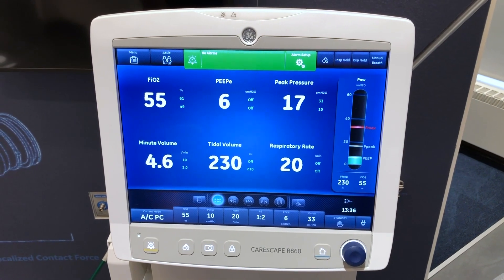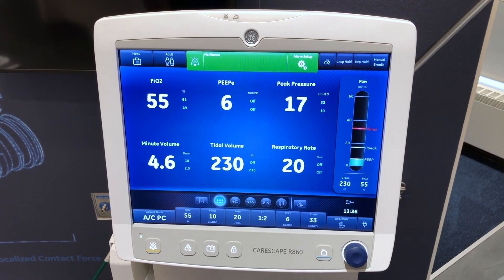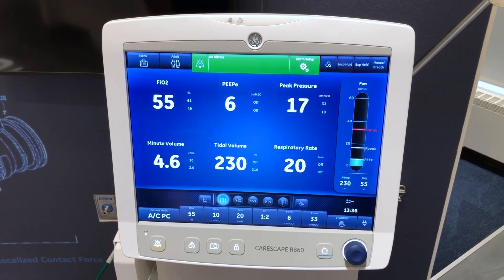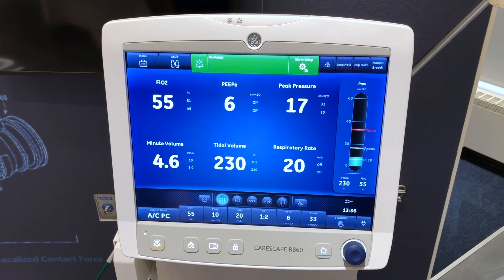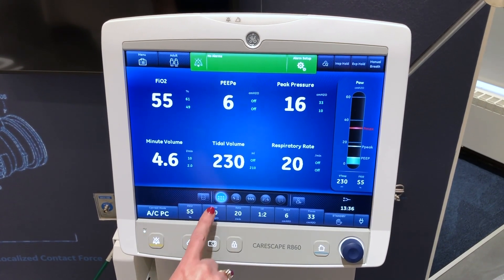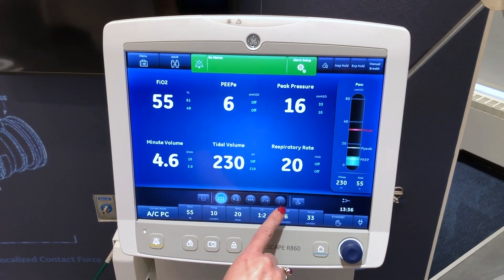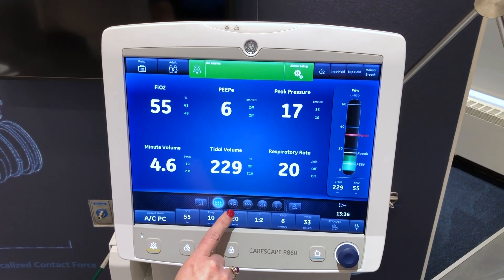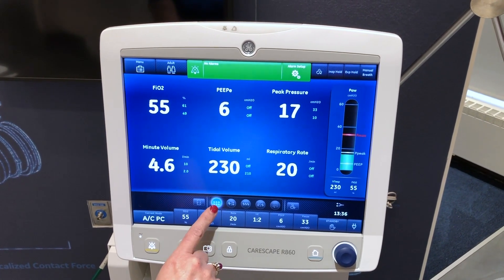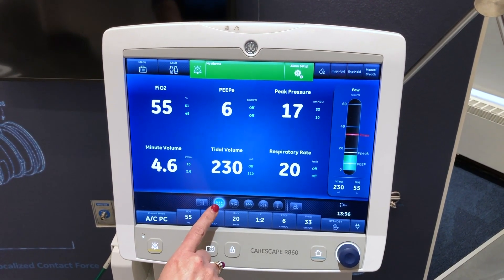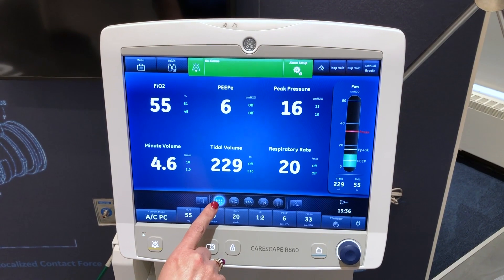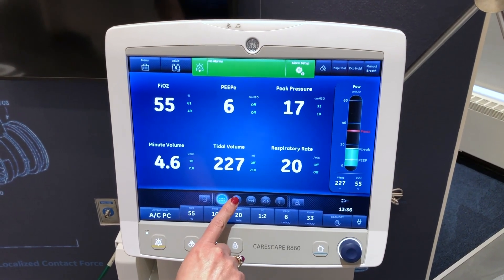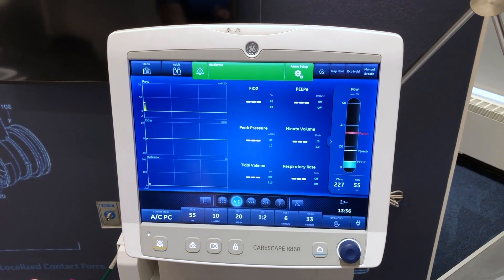In this video you will learn how to navigate the CareScape R860. Select the patient status workspace for access to basic view to see measured data in a large format that can be easily viewed from a distance. The basic waveform view to see patient waveforms and measured data.